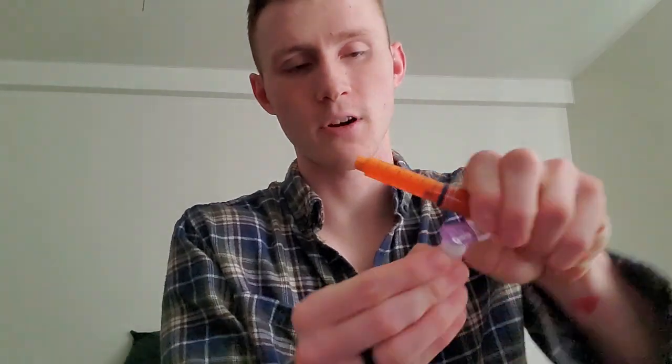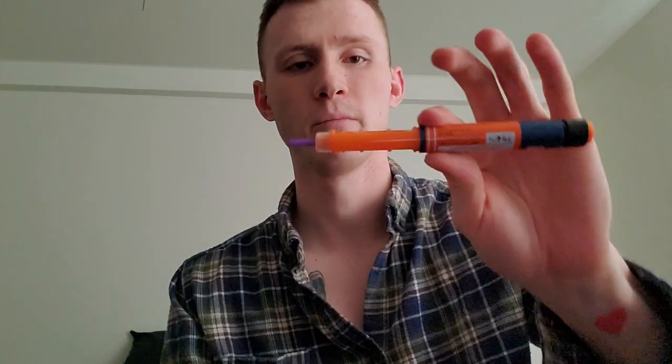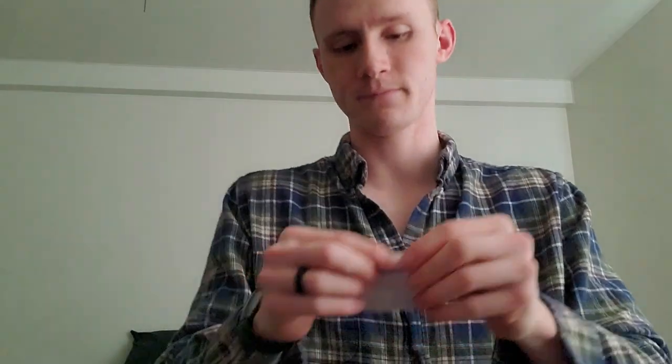So I take my needle, right? I take this wrapper off. There's a little needle insertion right there. You put it into the end like this. It connects, twist. It doesn't need to be super tight, just make sure it's snug. And there you go. Now you have this little purple cap covering the needle, and it's on your insulin pen. Put that down for now. Take my alcohol wipe, open it up.